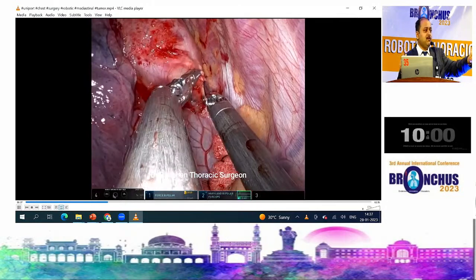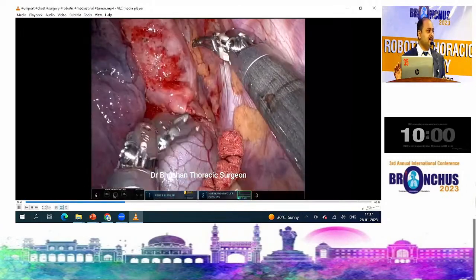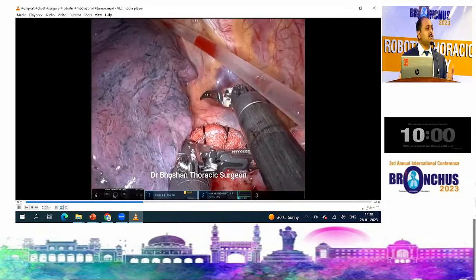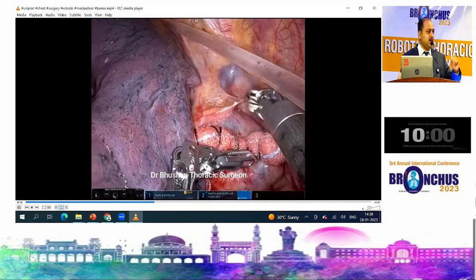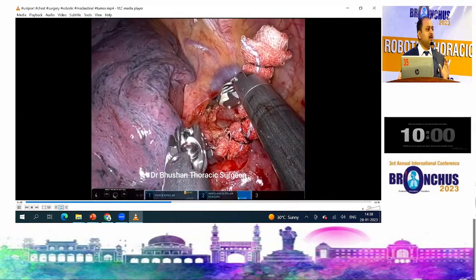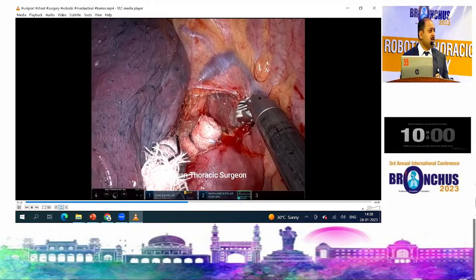Till that time you think over and your assistant is ready. We must always have the instruments and the sternotomy set available in the theater, and the consent has to be ready. All the plans and the CT scan should be discussed with your anesthetist and your assistant surgeon in detail before embarking on the case. Are there any adhesions near the innominate vein, SVC, where there are chances of a vascular injury where I will need to open? Everybody on your team should be on the same page. So it becomes a risk-free surgery, most probably.